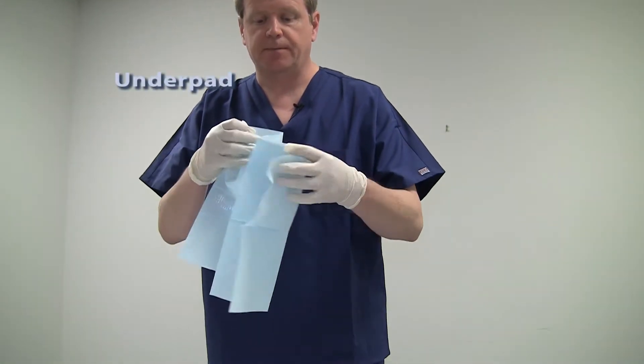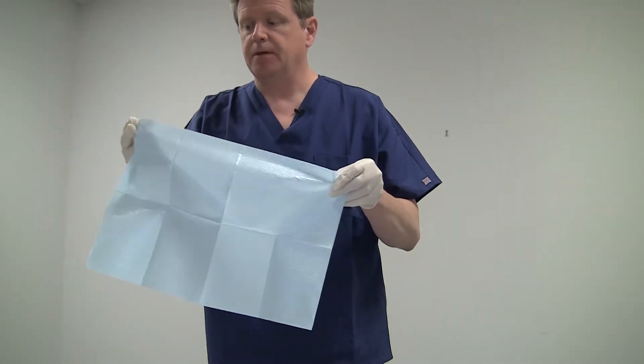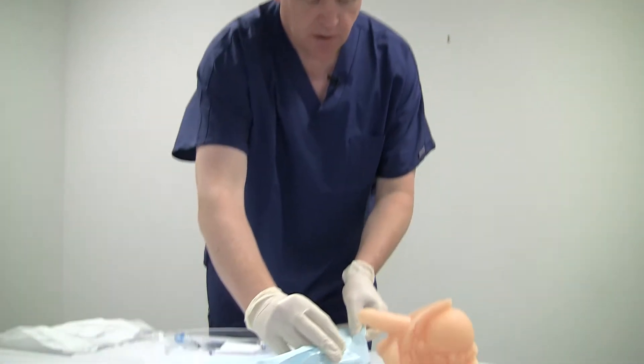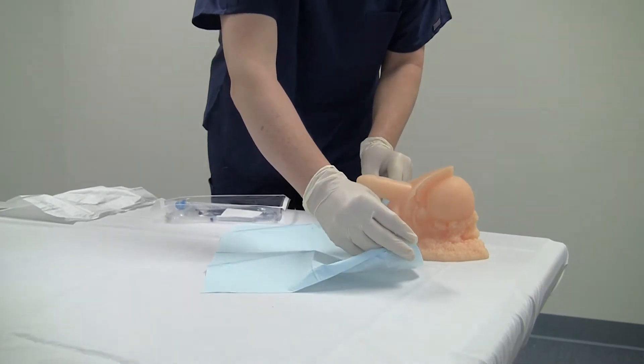After donning gloves, the next kit component we'll find is the underpad. You want to place the underpad shiny side down, paper side up, on the patient's legs with the anatomy above in the middle, just like so.